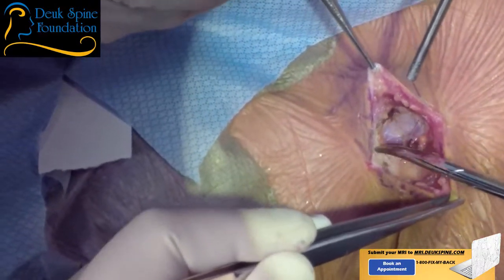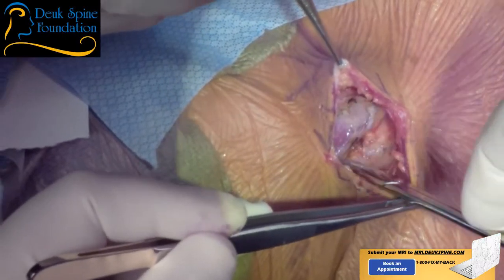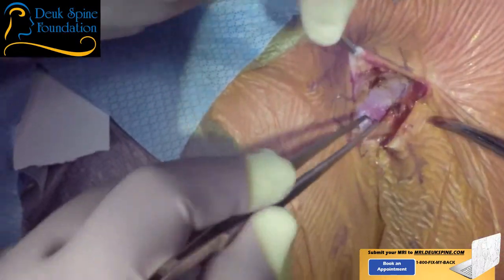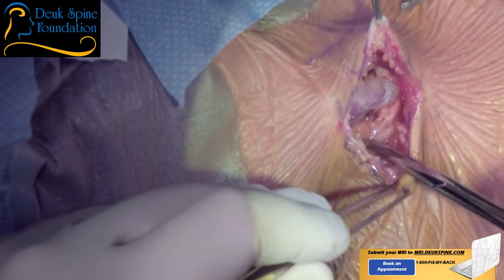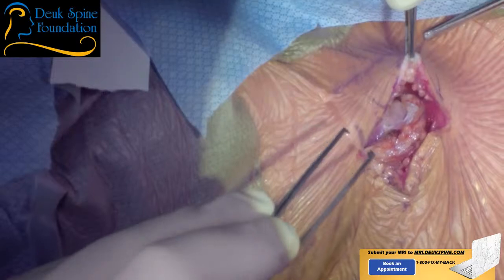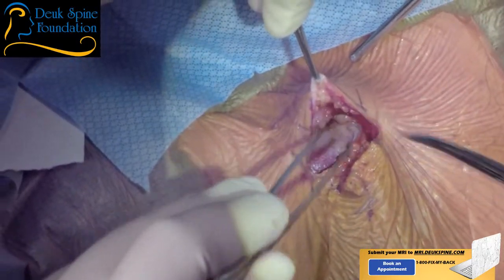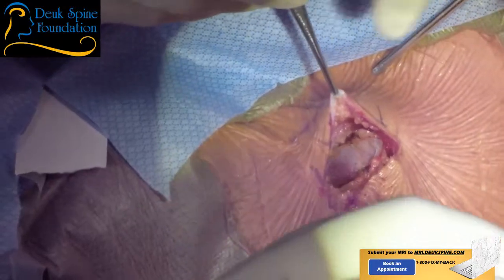All right, so you all can see we're making our way down. And I think this is the omohyoid muscle. This is the sternocleidomastoid here. This is the omohyoid. And so far, things are going well. The platysma muscle is up here. We just need to keep going until we hit the spine.